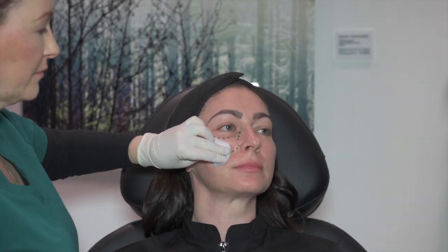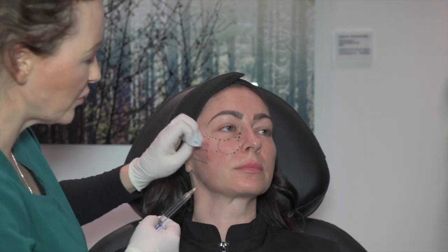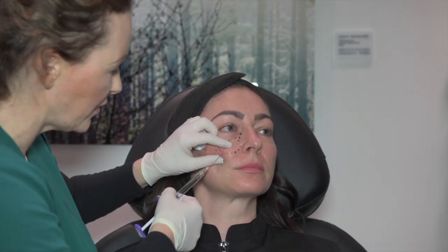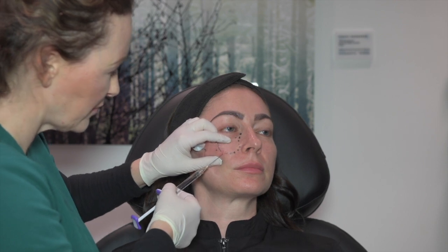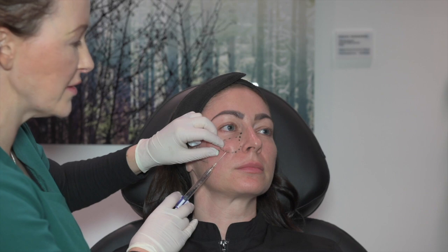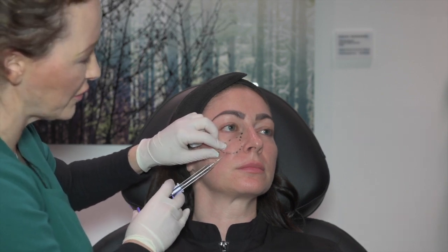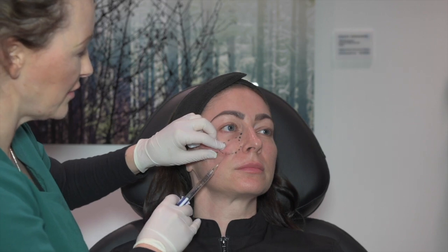Next, we're going to move on to CK3 Soothe, which we're going to treat with Volift, 0.5 mils. We'll clean, needle entry point, pinch. The way to achieve this exact tissue layer is to inject, and then immediately we're into the tissue, we track backwards as if pointing back towards the skin. And then in a fanning motion, we inject 0.5.